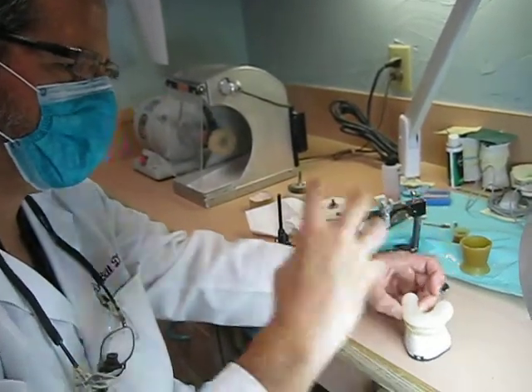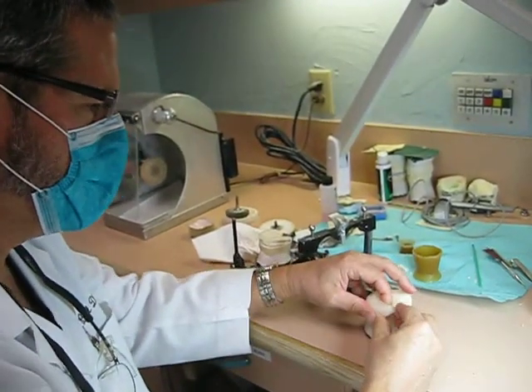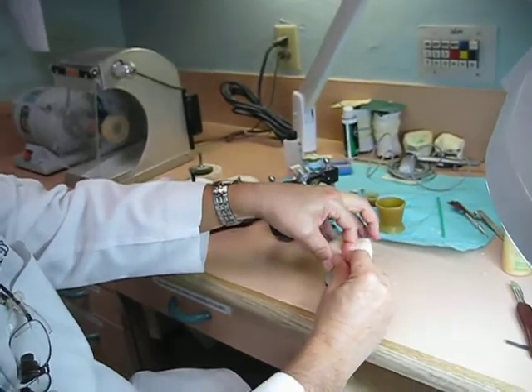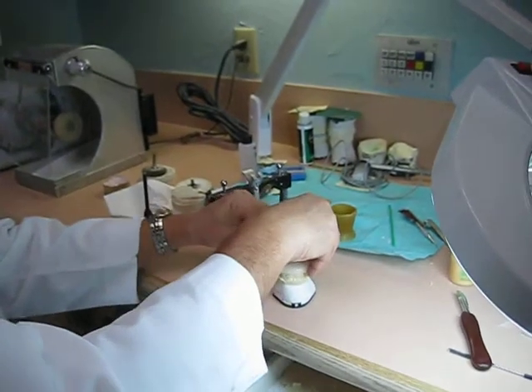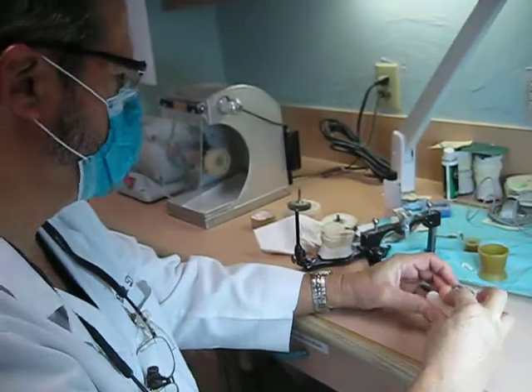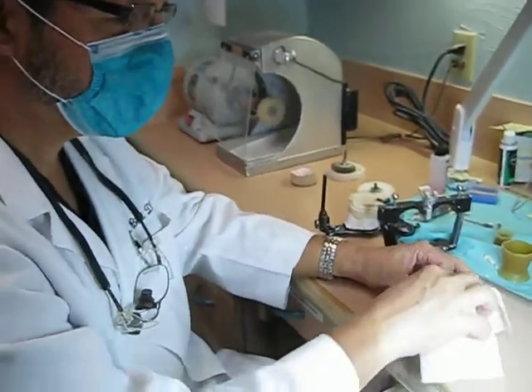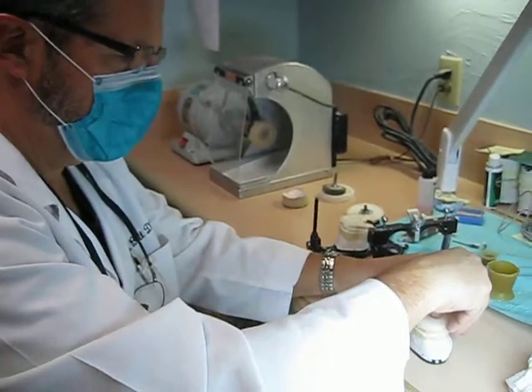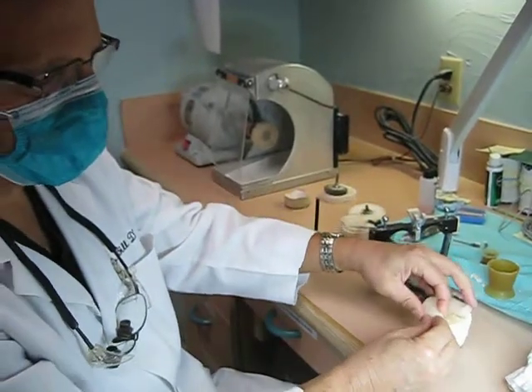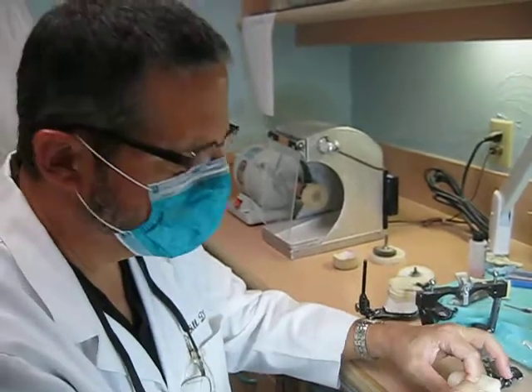And as it starts to heat up, it starts to shrink wrap around those teeth, and it's getting warm. Not too hot, but warm. And I'm not going to let go of it until I can't stand it anymore. Because I don't want it springing away from the tooth and setting in a sprung fashion, meaning where it's flared away from the teeth.